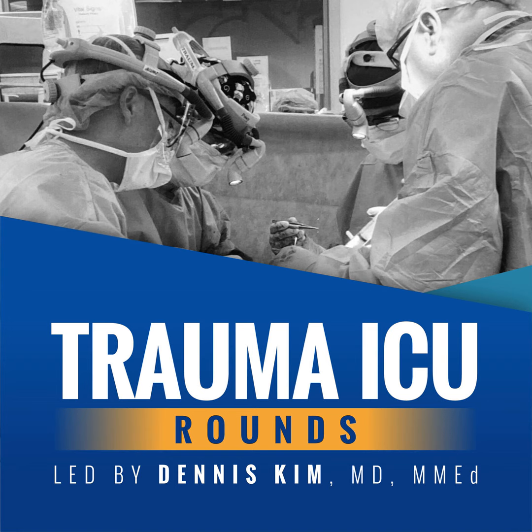Resistance, or frictional forces, primarily occur as a result of the anatomic structure of conducting airways and the tissue resistance of both the lungs together with adjacent tissues and organs. Now, many things can increase airway resistance, and in an intubated patient, that includes the ET tube, but patients can also develop mucus plugs and have bronchospasm, just to name a few causes.